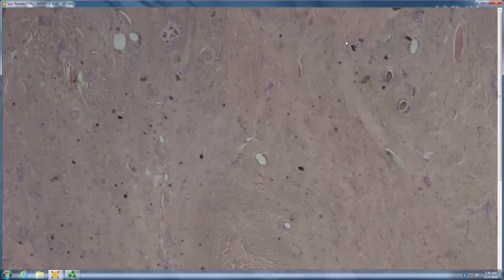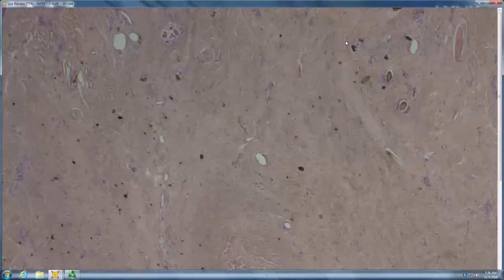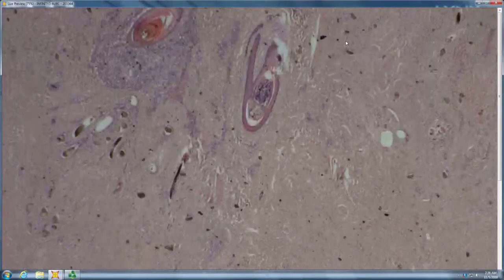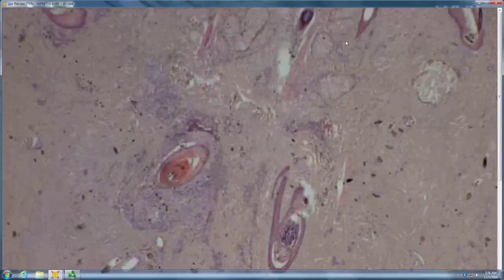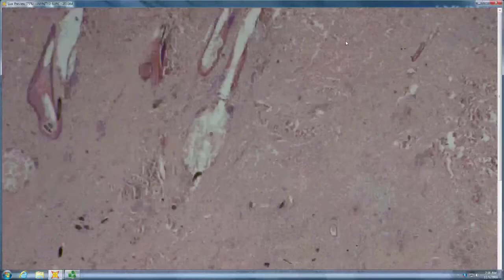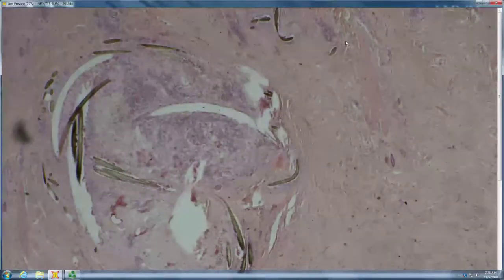In the biopsy site or in the person? In the name. Oh, okay, not in the tissue. Right, it's a misnomer. There's no keloid in acne keloidalis. Just scar. There's hypertrophic scar in acne keloidalis, right? So you see hypertrophic scar, ingrown hairs, suppurative process, and then often there are many plasma cells in the infiltrate, which is just a clue to it being nape of the neck, right?